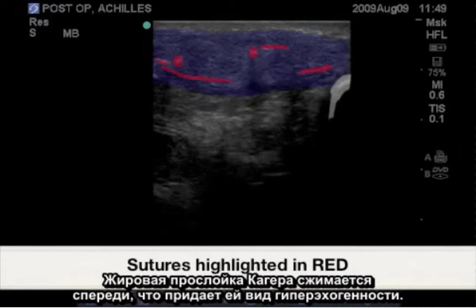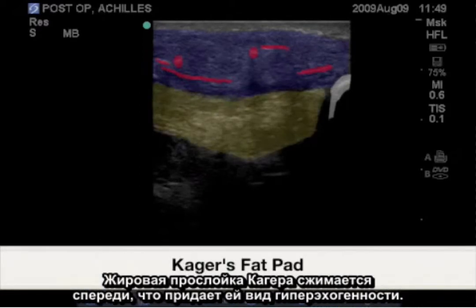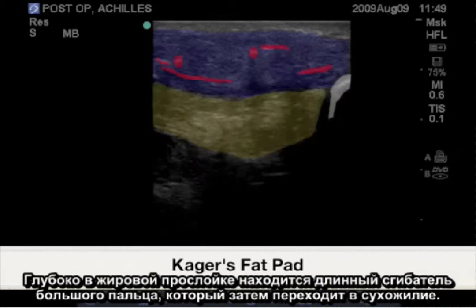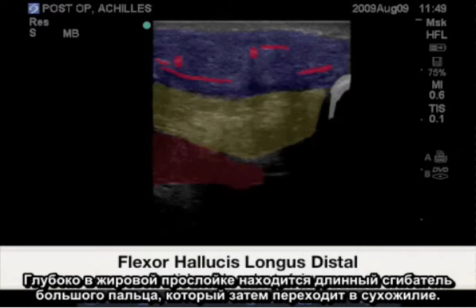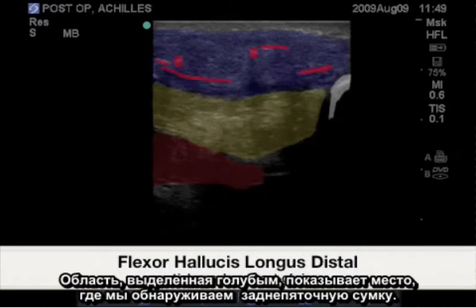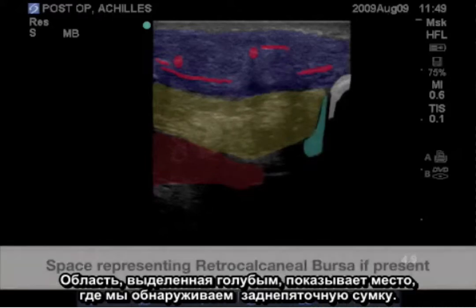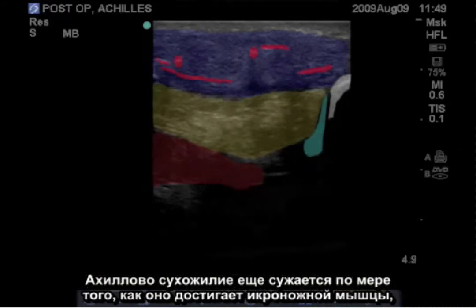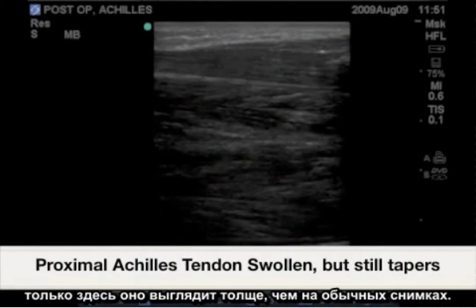The Kager's fat pad is compressed anteriorly, making it appear hyperechoic. Deep to the fat pad is the flexor hallucis longus muscle before it becomes tendon. The light blue highlighted area represents where we would find a retrocalcaneal bursa. The Achilles tendon still tapers as it reaches the gastrocnemius, only thicker than in the normal images.